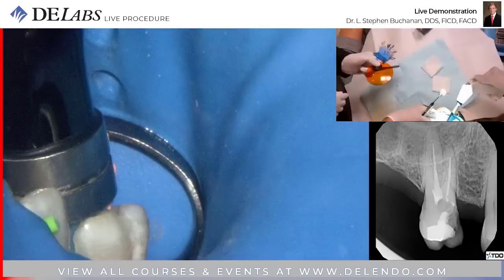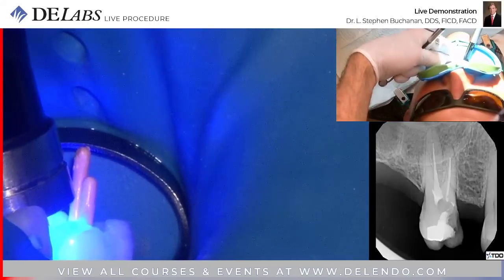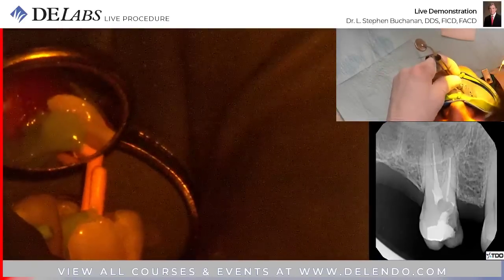Would you not have to do this step if that wall wasn't broken out? If the wall wasn't broken out, then I'd just be layering it around the tooth and on the occlusal surface. Yeah. But we made it really complicated.